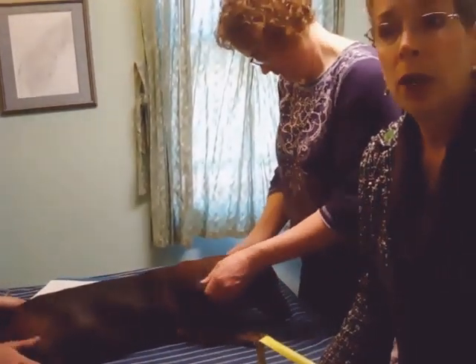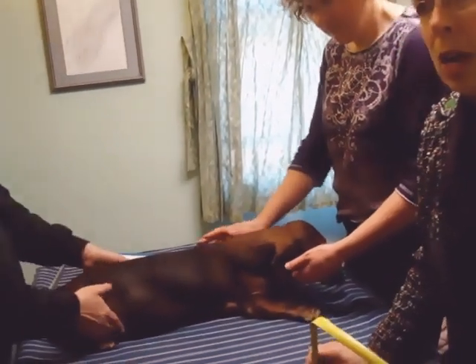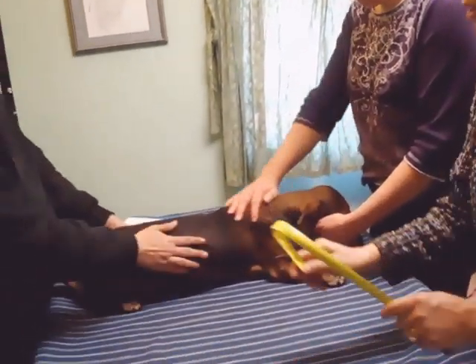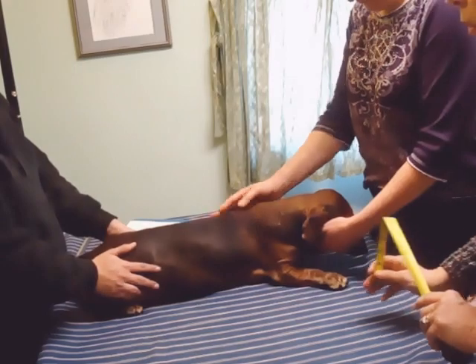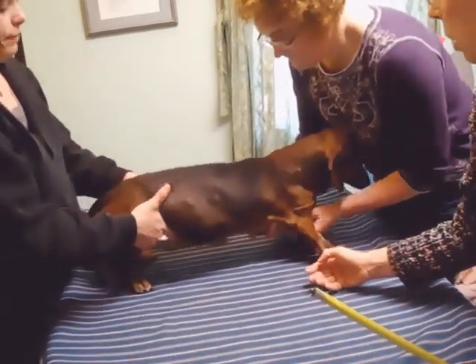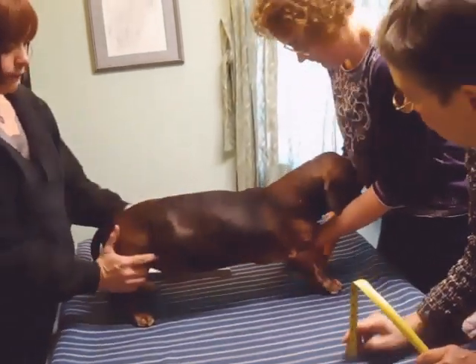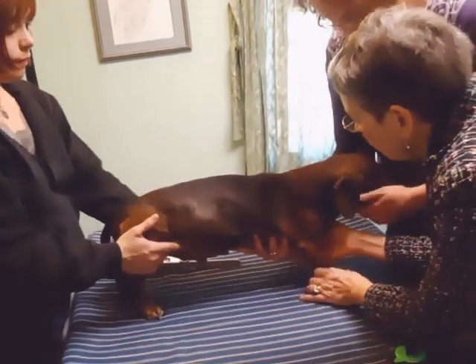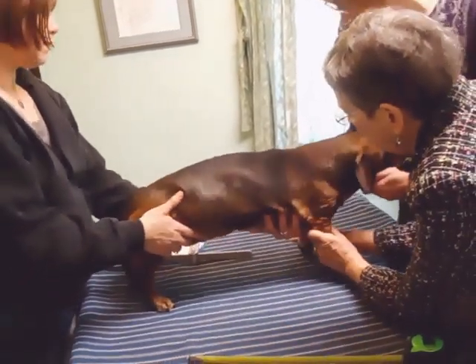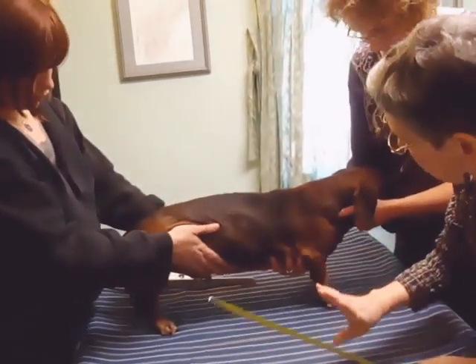The measurements you take for a quad or front wheeler are the same. The first thing you want to do is to have a team of people — a person at the back and a person at the front — supporting the dog in a healthy, normal weight-bearing stance. You want to make sure that the front legs are weight-bearing and standing under the shoulder blades.